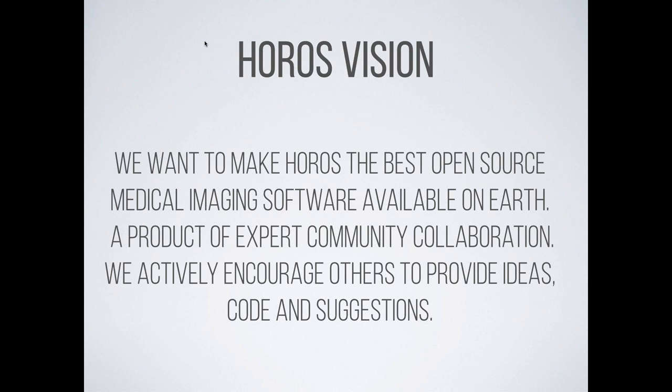And that is something that Osirix had achieved many years ago when they made Osirix and made it available in the open source community. And that is something that we intend to carry forward. The best medical imaging software available on Earth as open source. Horos is a product of expert community collaboration. It means that as we carry Osirix forward, as we carry Horos forward as the open source version of Osirix, if you will, we want to ensure that it is positioned in a way that allows people around the world to participate in its development, in its growth.